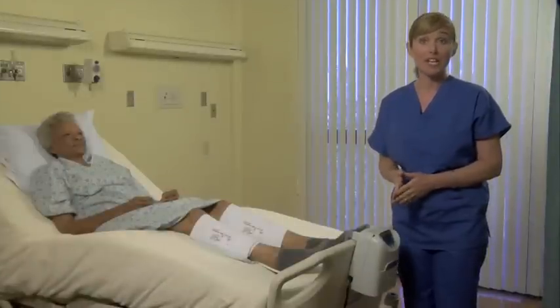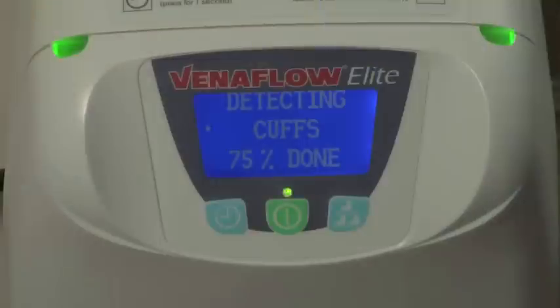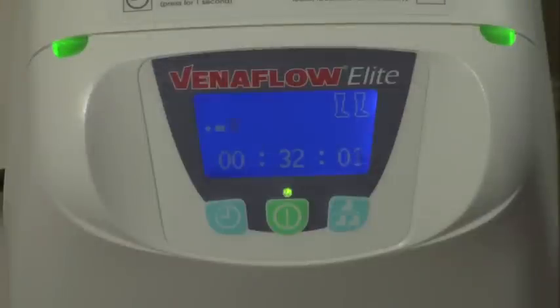If you'd like a single leg application only, you must wait for cuff detection to complete at 100%, and then the screen will switch to ramp up. The screen will show a diamond icon on the left side indicating ramp up. When that diamond is gone, ramp up is complete. During the three minute ramp up period, you must select single leg application if desired. Simply press the single/dual leg button and check that there's only one leg icon featured on the screen.